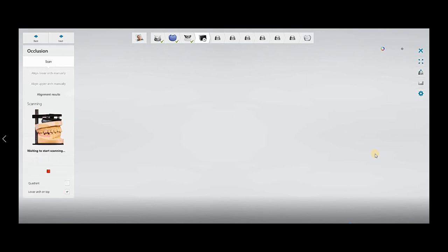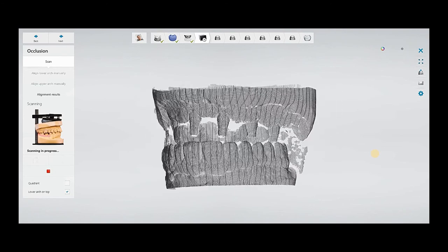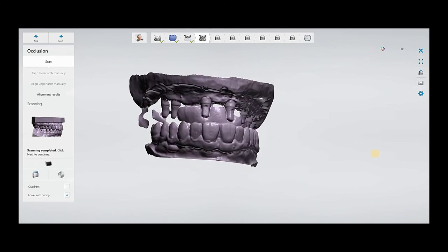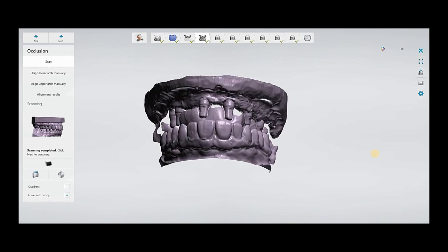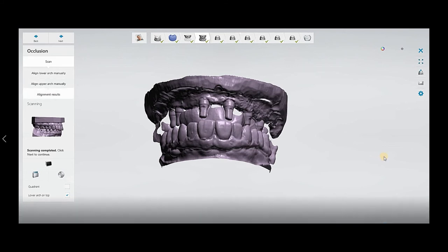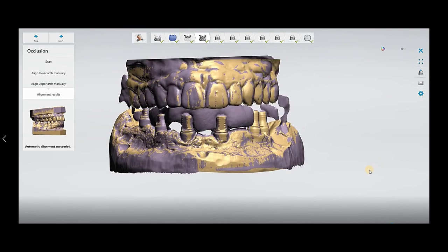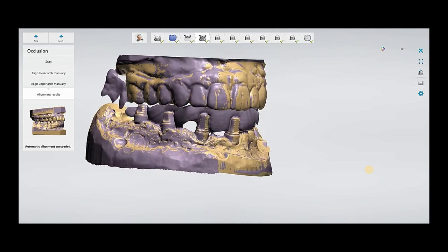After that you have to scan the bite. Put the bite in to select — it will put the lower arch up, then you can select the lower arch on top and scan the bite. The bite has scanned; it will process and automatically align. You can see the alignment results — it is perfectly aligned with the bite model, the upper and lower.